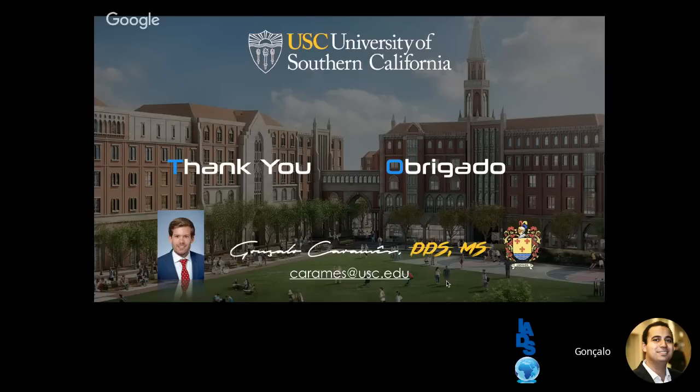So in this case, as you saw, it was a case of altered passive eruption. It was one of those cases where it's indicated, and we can do an aesthetic crown lengthening to reduce the gummy smile. What you see in many cases of altered passive eruption is a papillary frenum. But I wouldn't say you have a gummy smile and high frenum attachment in every case. Sometimes, for example in the first case, when I did the frenectomy, it actually increased the gummy smile. The mobility of the lip was increased by releasing that excessive hypertrophic frenum, and it caused more mobility. So in terms of the gummy smile, it will depend definitely on the etiology, and there are different etiologies, but definitely in this case we had altered passive eruption with that papillary frenum.